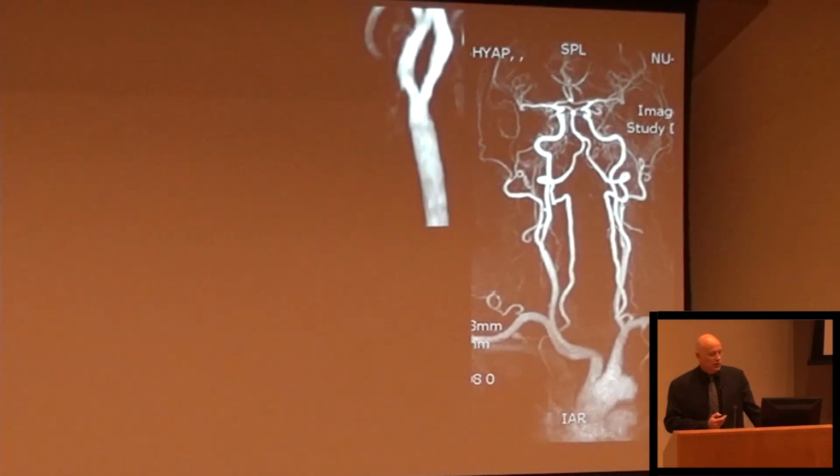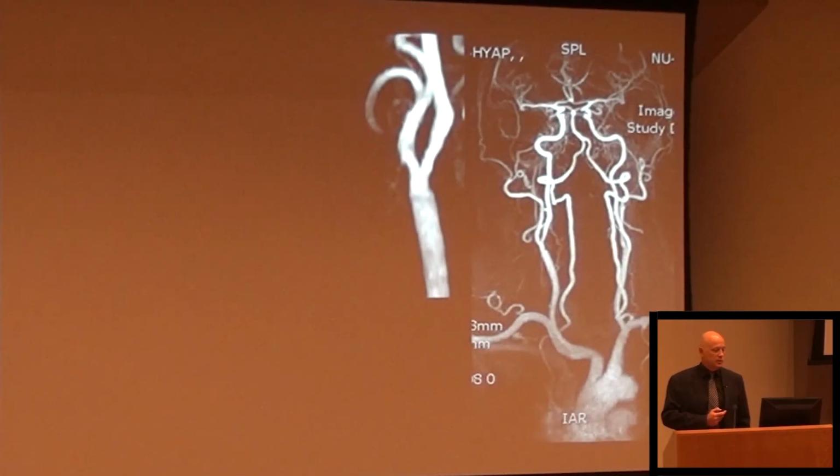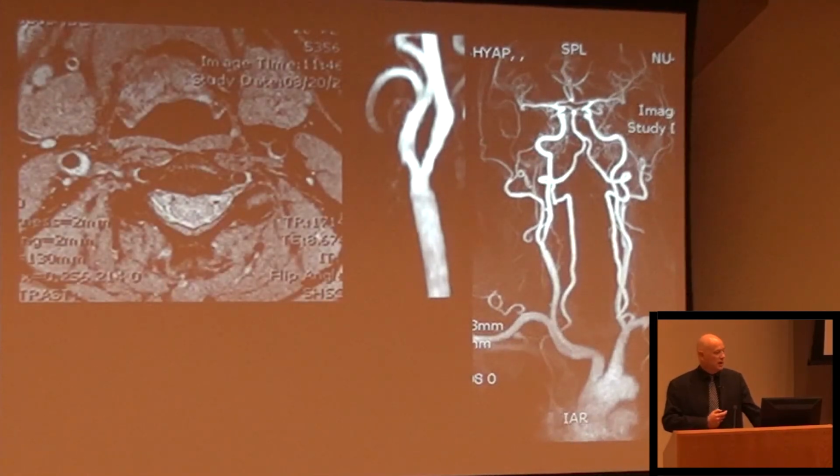And so we get to the CANE project, which Jean-Claude mentioned, and this is really the imaging sequences that we use, so that we can look at the whole of the carotid circulation with a contrast-enhanced technology. We can use time of flight, which is non-enhanced, to get high-resolution images of the carotids. And then we can start to look at the vessel wall and lumen itself, which in this case on the luminogram, on the angiogram, looks relatively normal.